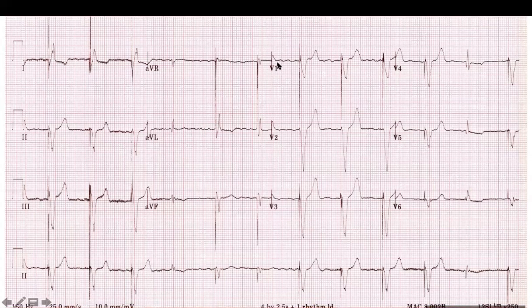So if we go to V1, you could actually see very nice atrial activity. Here is a little bit positive, but then here negative. Here is very sharp negative. Here is more wider negative. Here you go, it's a little bit positive, positive, then negative. So there is multiple morphology and it doesn't seem to be organized. So I would call this atrial fibrillation, actually.